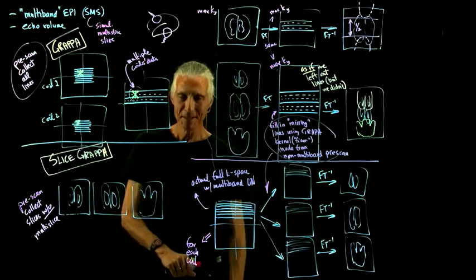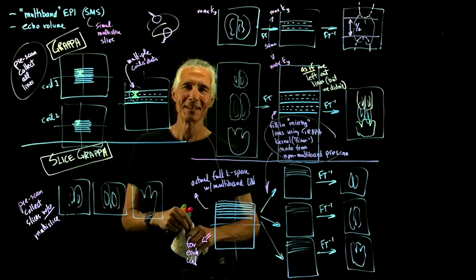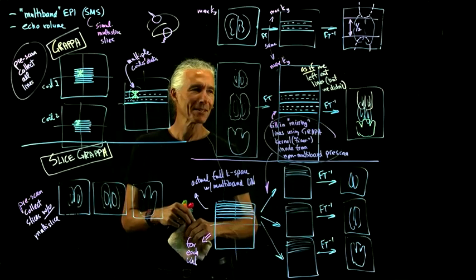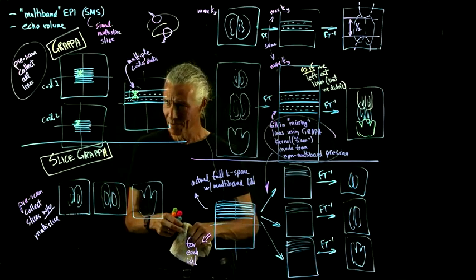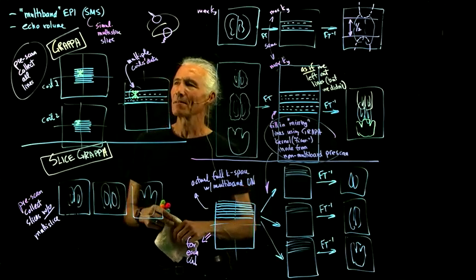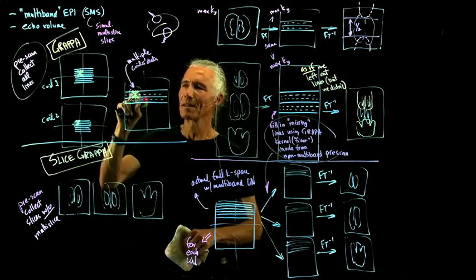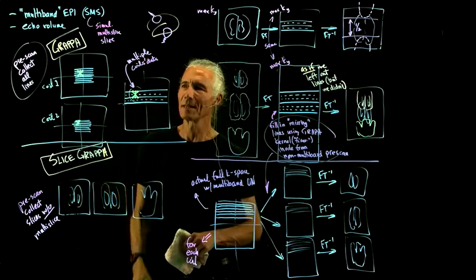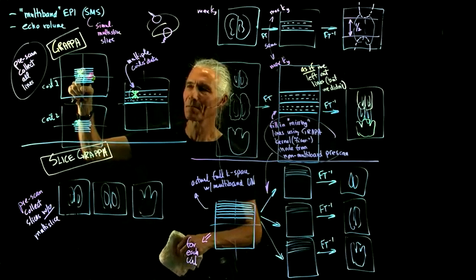Okay, so any multiband questions? Last multiband questions. Or GRAPPA questions, like how does this work? It's like filling in, making a little fixer that uses the surrounding points in K-space to interpolate and fill in, based on K-space that is completely filled.